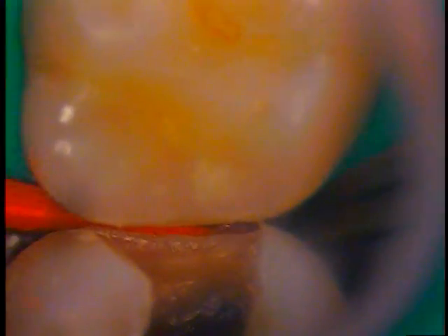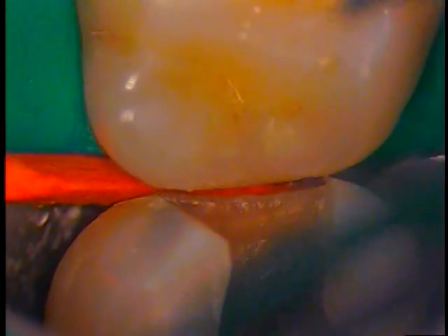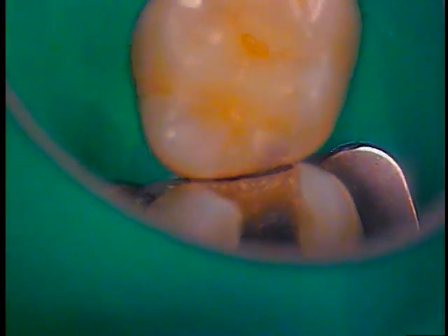So I might have to switch it out. Let's see if I can push that in any further, might be able to hold that one in. Okay, so we'll loosen that up a little bit. All right, it's all about feel.